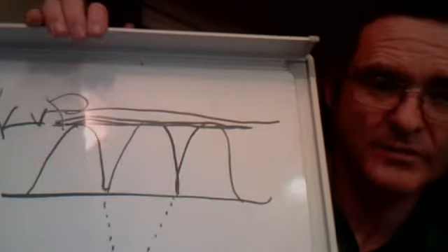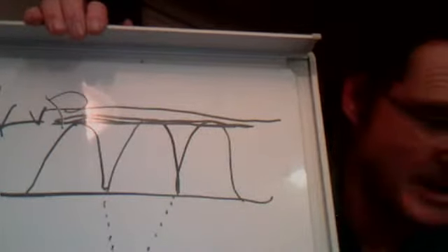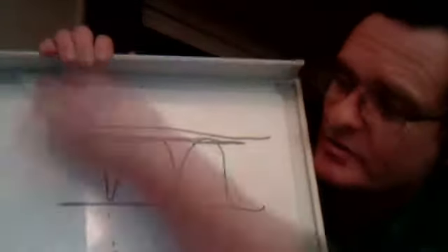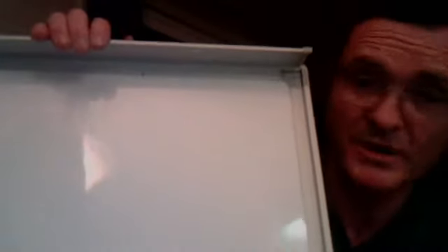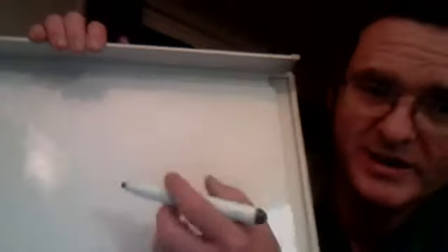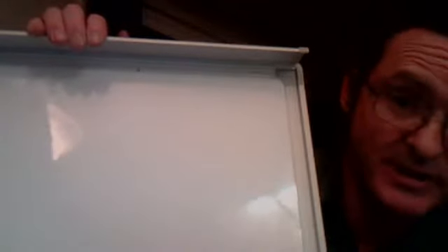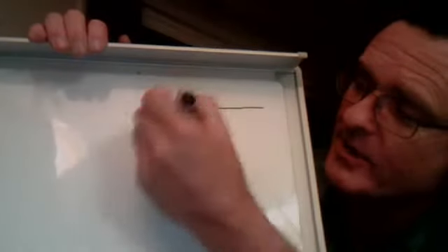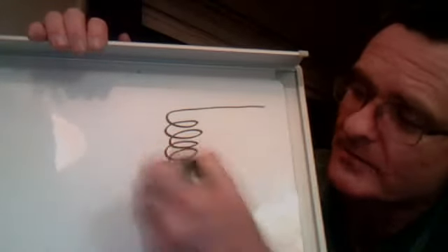Okay, now, the only last thing I need to probably explain here out of this chapter would be some of the components that are actually used in the dental x-ray machine. The first component we want to talk about would be the transformer, and what the transformer does is, going back to the same principles we used in the generator to generate electricity, you can take electricity and run it through a coil of wire.